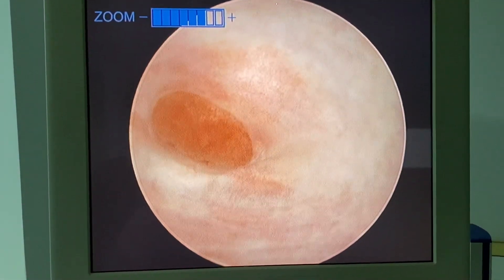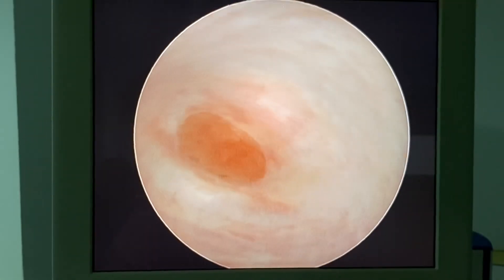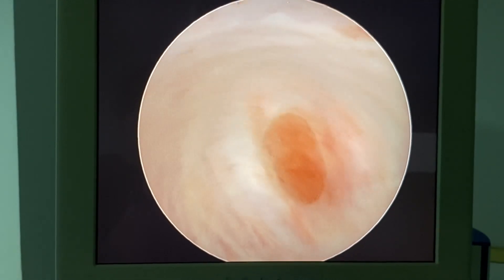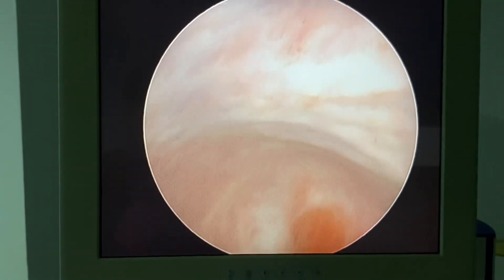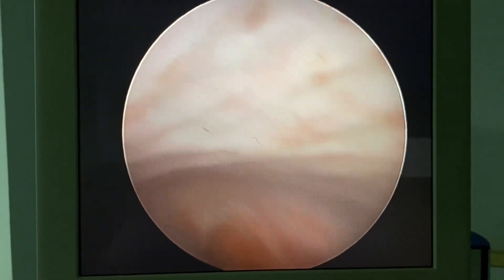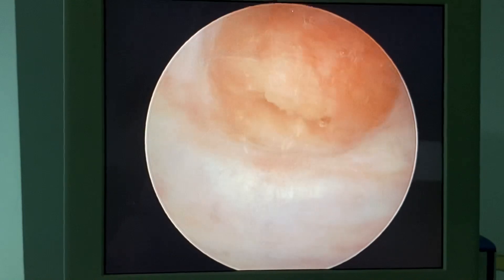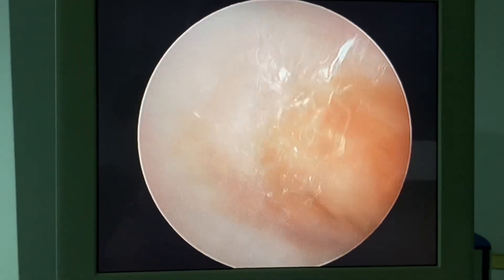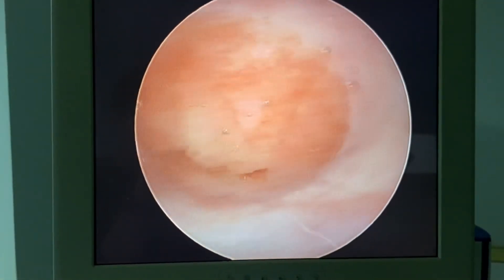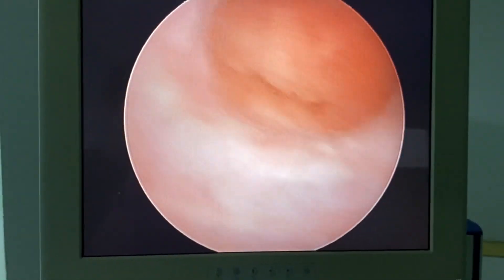Real vaginoscopy means endoscopic examination of the vagina. You can explore the whole vaginal circumference — you can see the vaginal wall, the mucosa, the rugae — and then glide to see the posterior fornix, the lateral fornix, and also have the opportunity to examine the cervix better than a colposcope.